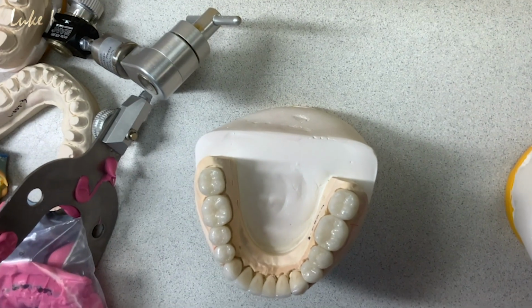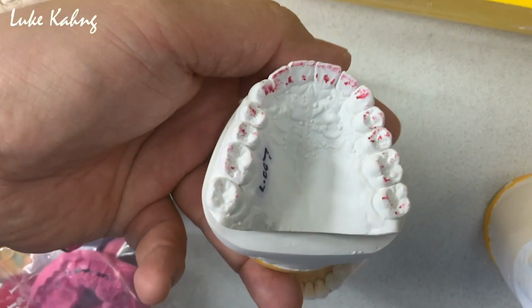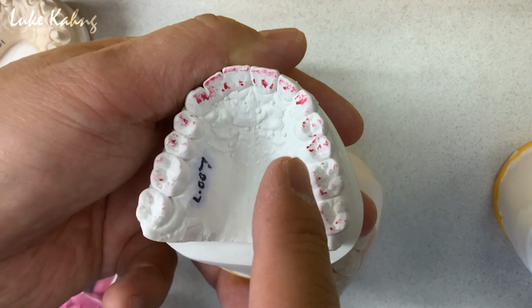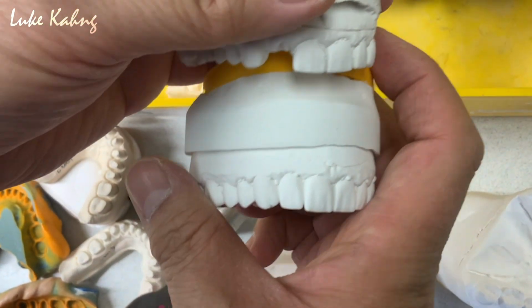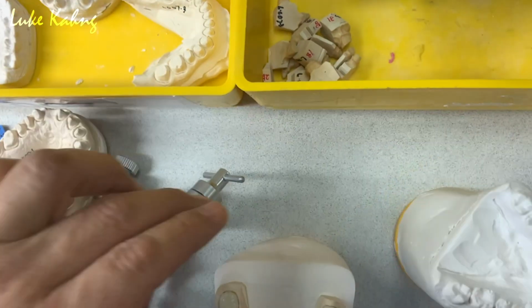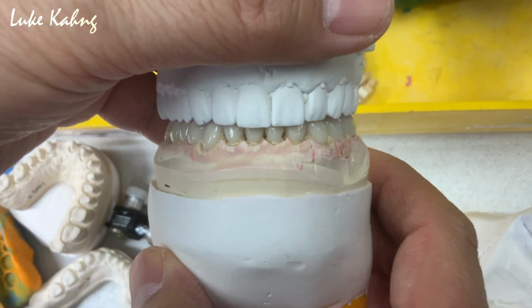And then after that, after the doctor placed the cases, so took the exactly what I fabricated. So this is our fabrication from here to this. Make sense? So we change the central here, side view, the golden proportions, and then we fabricate the lower here. All right. So we fabricate and finalize, done.